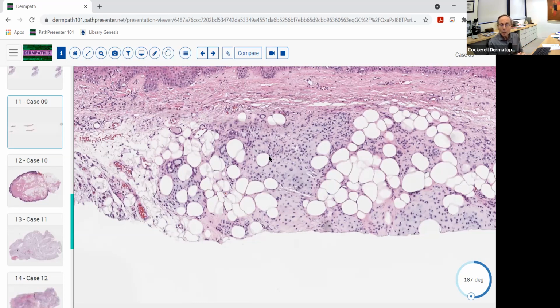Possibly, but if it didn't, and it actually was a neoplasm that really and truly was a hamartoma, both of fat and cartilage, you have the possibility of Proteus syndrome in that situation. So that's the pearl about this slide, is that Proteus syndrome can give you these so-called mesenchymomas.